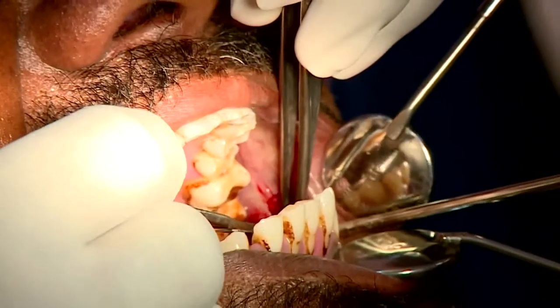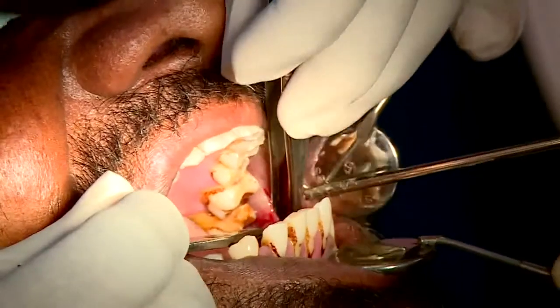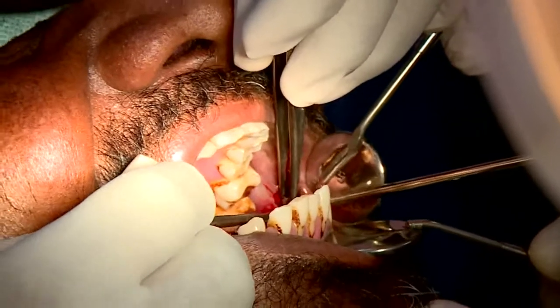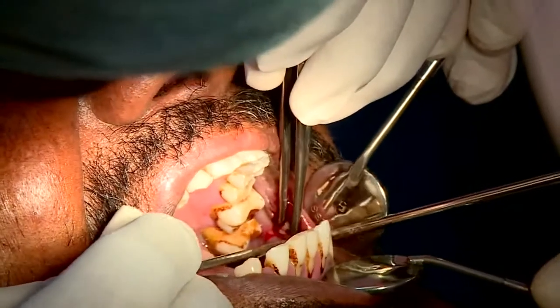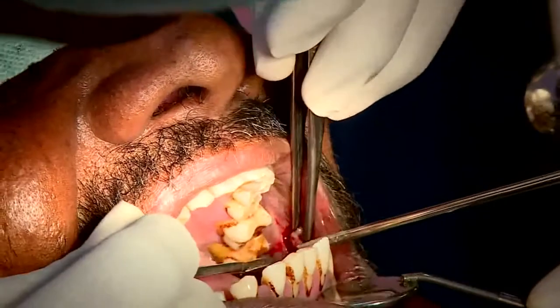Similarly, I made the superior cut, now I am trying to make the inferior cut here. You can see how they are using the tissue holding forceps.